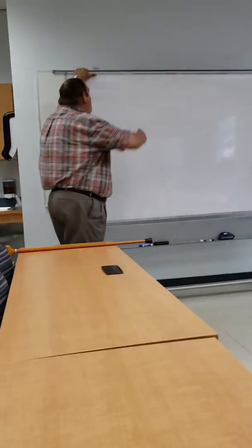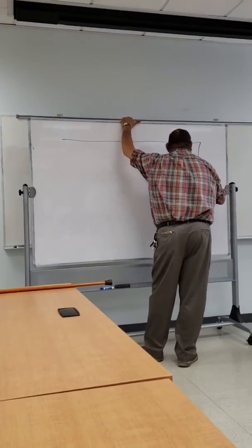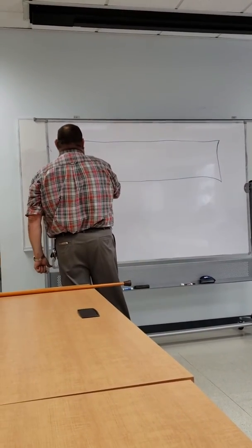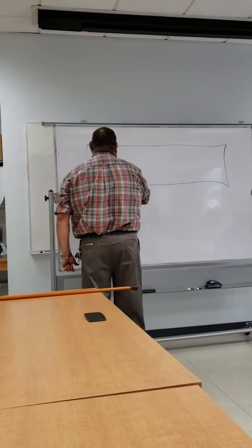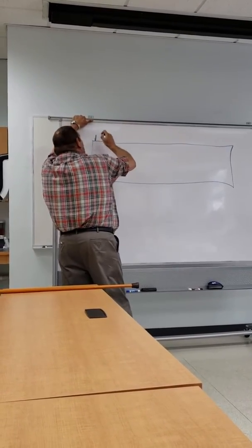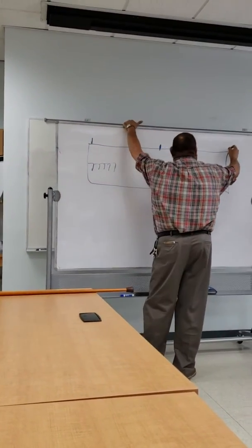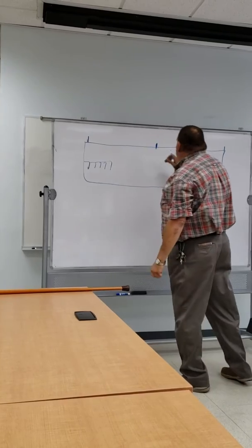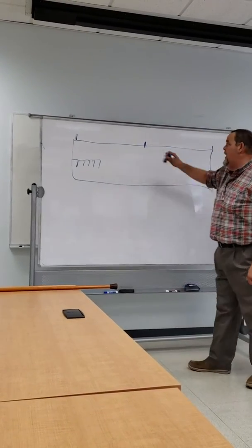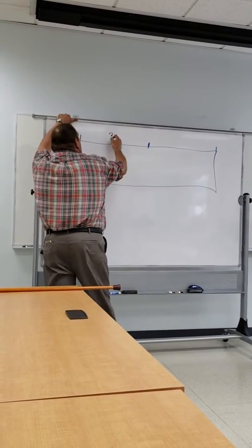Okay, now, when you're looking at that strip of paper, and you've got all these little blocks in here, at the top, you're going to have a line like that, like this, and like this. It's going to be at the top, at the bottom, somewhere. There are going to be these lines right here. They are 3-second lines.